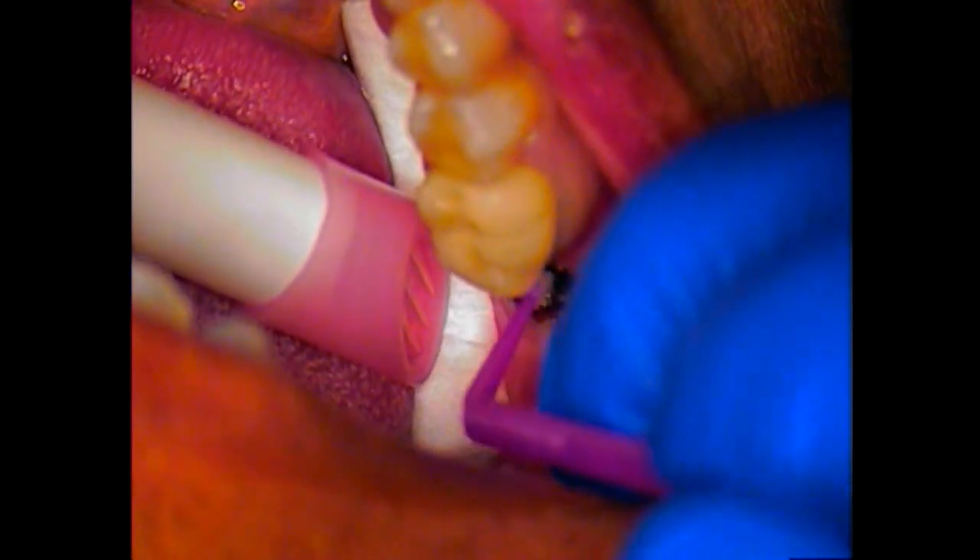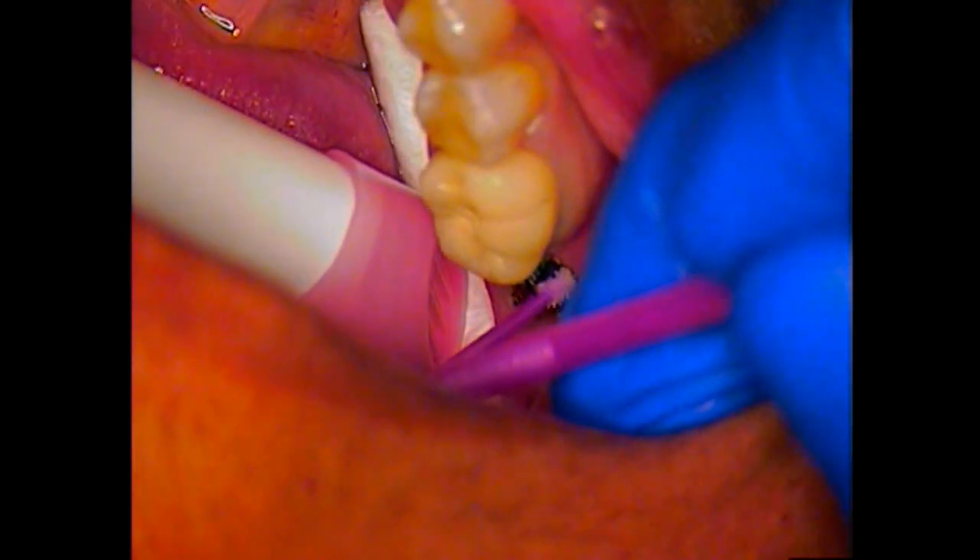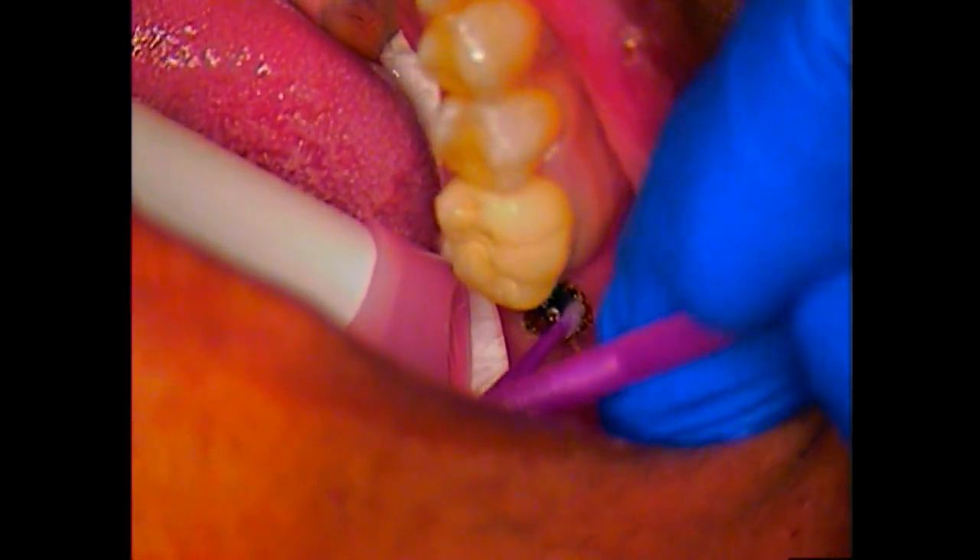We're going to use some of our pre-made solutions. This one's tartar and stain — that's what we use for our patients. It works great with appliances that go in the mouth, both fixed and removal appliances. We'll put one drop of tartar and stain and let's see if that penetrates around there. You can see the change of color right away — it goes from a clear to an opaque color. My dental assistant is now going to just turn off her suction but stay retracting, to allow more solution to go in and penetrate.